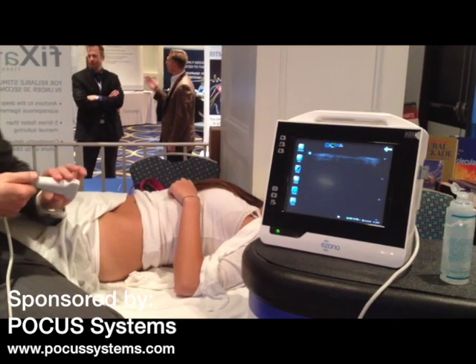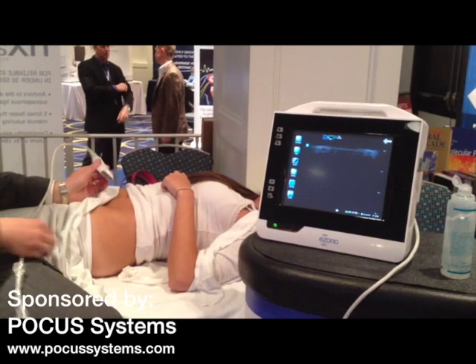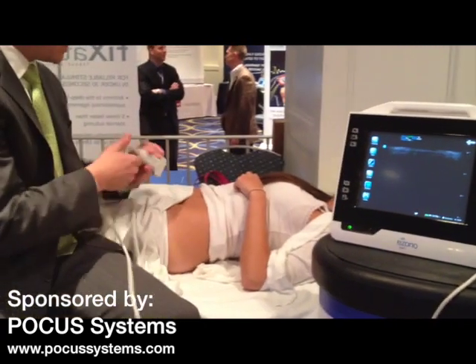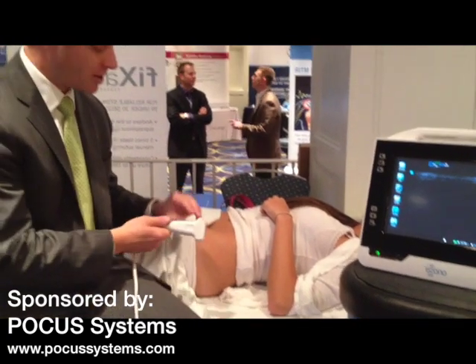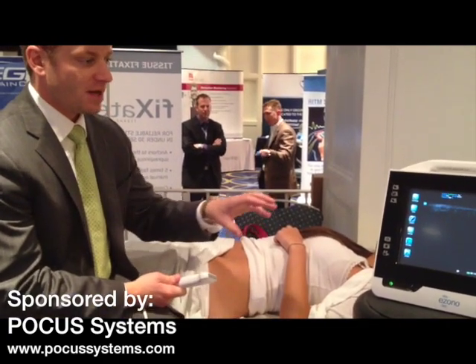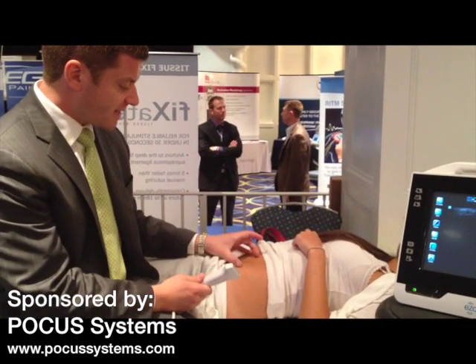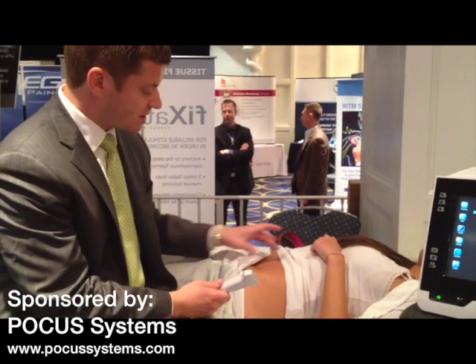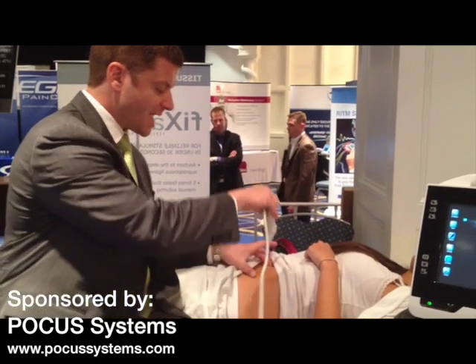We're also using a model. So what I want to do first is I want to identify the ASIS and get the right angle. Angle is extremely important for this procedure. So at the ASIS, what I want to do is angle the probe towards the patient's belly button — ASIS to the belly button. That's going to be my angle.